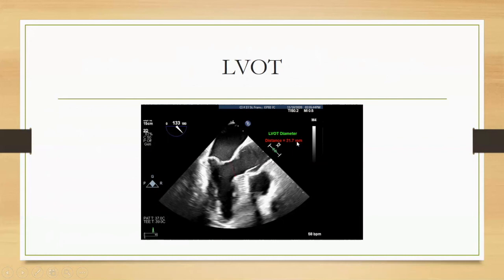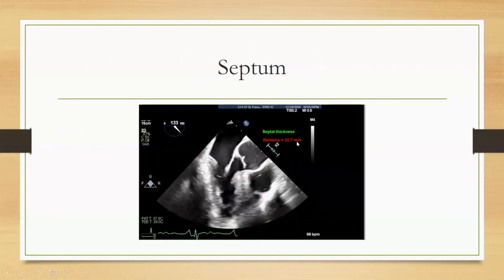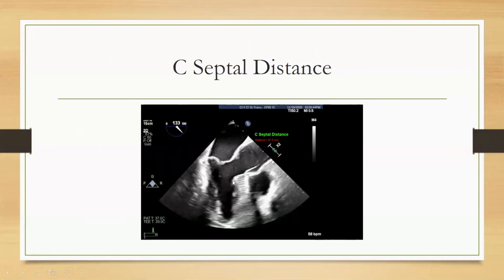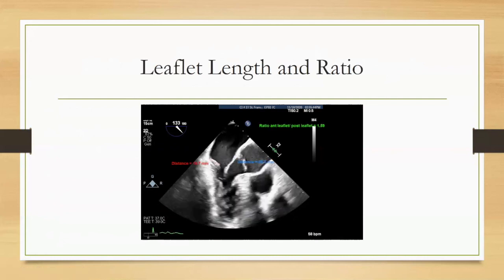Here it is slightly narrower, and our LVOT diameter is 21.7 millimeters. As to the septum, it's significantly thickened at 22.7 millimeters. The C-septal distance is taken from the location where we measure the septum, and is taken to the coaptation point of the anterior and posterior mitral leaflets. Furthermore, we can measure the distances or the lengths of these two leaflets. Here we have a ratio that is 1.59, which means that we are at increased risk for postoperative SAM and LVOT obstruction.